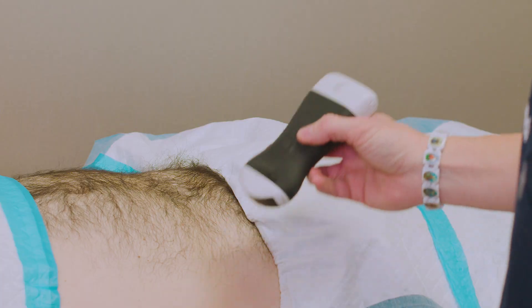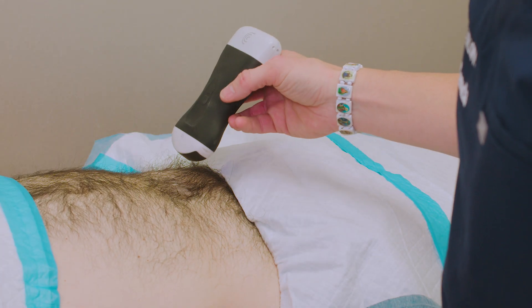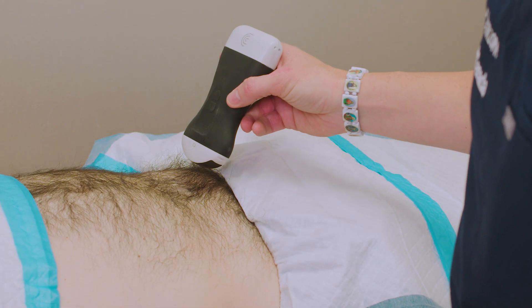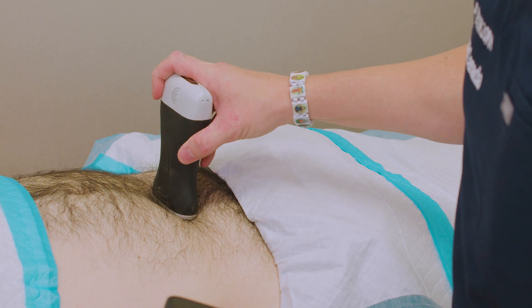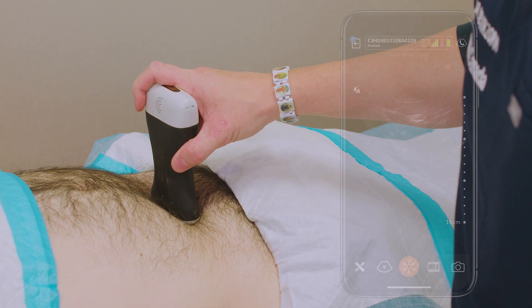So let's begin. I've already applied the gel to the patient's lower abdomen just above the pubic bone, and I'll apply and start the filming.